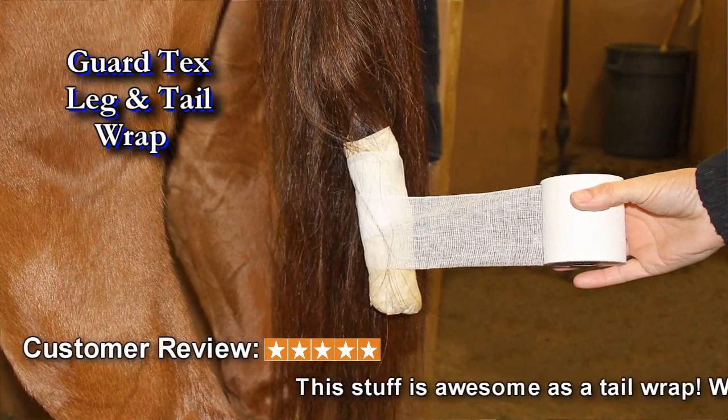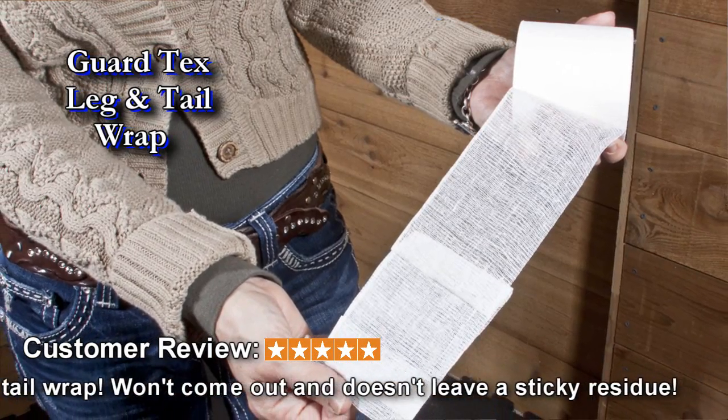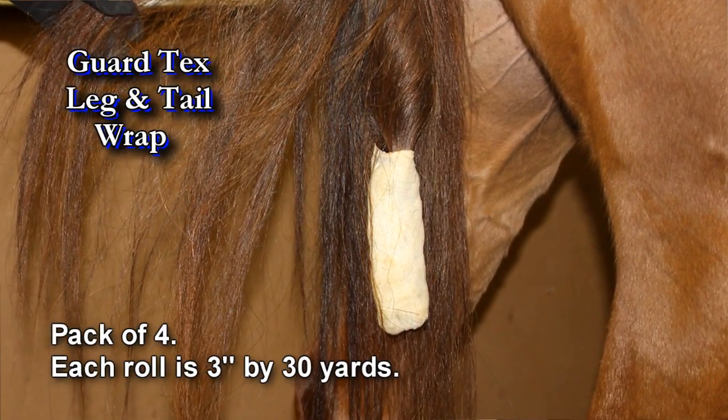GuardTex — wrap a leg, wrap a tail. It's the universal bandage that sticks to itself and not to skin or hair. Great for foaling, and the best way to keep beautiful tails out of the mud and off the ground.